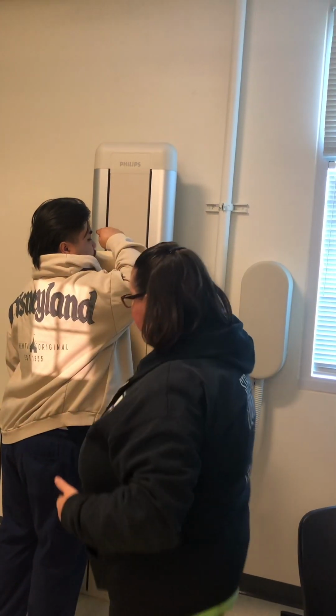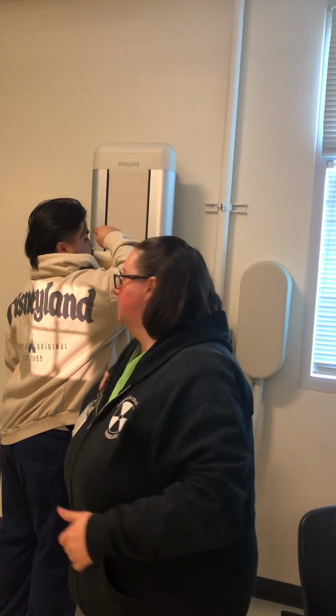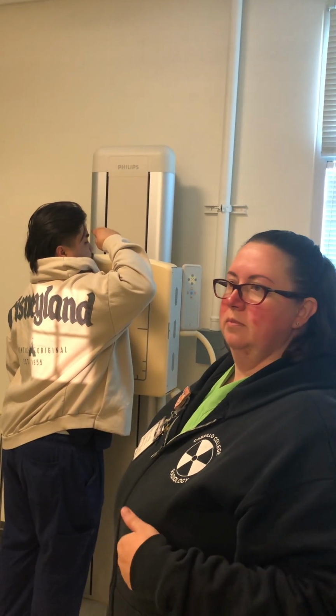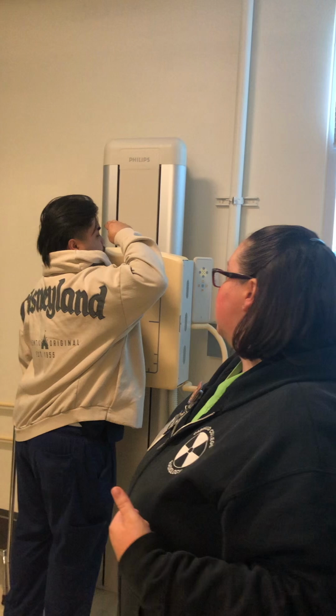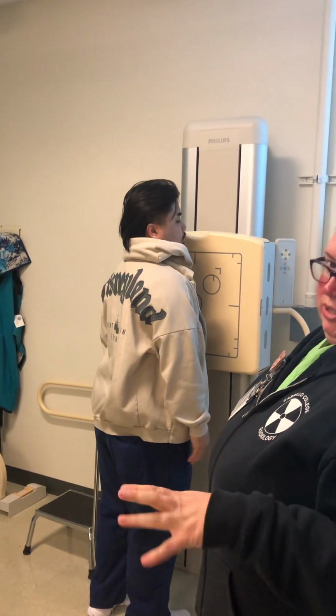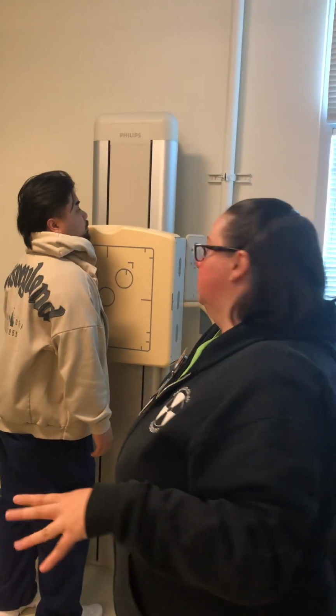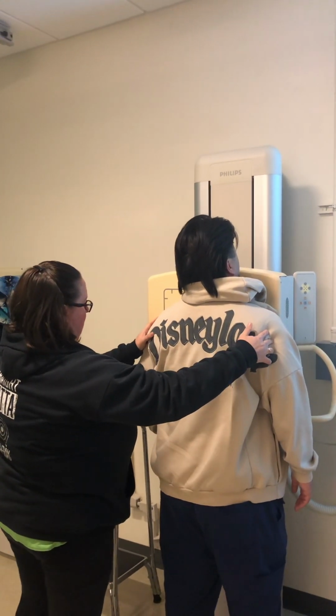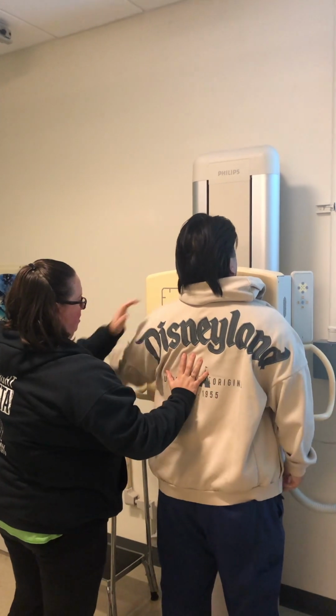Again, take a deep breath in and hold it. And that's our other position for this injury. Good, relax. Questions about that one? Okay, so doing the other side, you're going to shift to your right. Let's stay straight first. Back this way a little. Left arm up to your forehead.